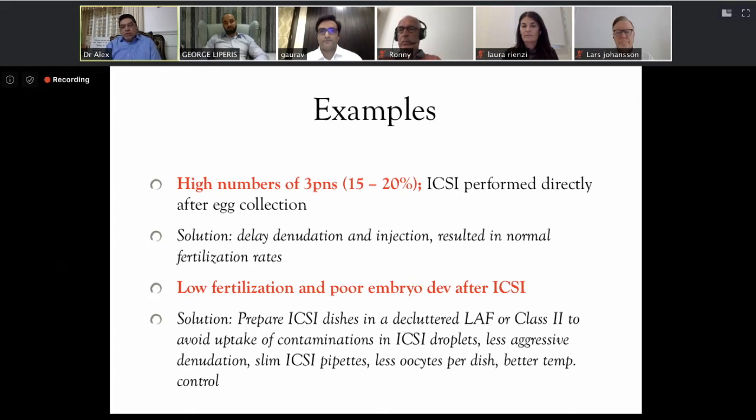Since you mentioned that prevention is better than the cure, we were doing a validation of a tri-gas incubator. In that clinic, we connected with the locally available carbon dioxide and nitrogen, and we did a sperm survival study along with a control in a small laboratory incubator that is connected to only carbon dioxide.